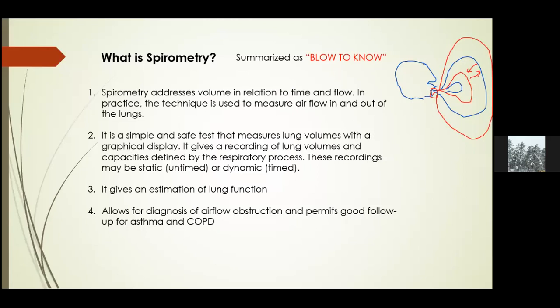So the only thing that you can be able to measure is the air that leaves your mouth and the air that gets into your mouth, but you cannot measure what is in the lungs. For that reason, when you look at spirometry, you will have a mouthpiece, and that mouthpiece will be capturing all the air that you are breathing out, and that volume will be measured. It will be quantified.